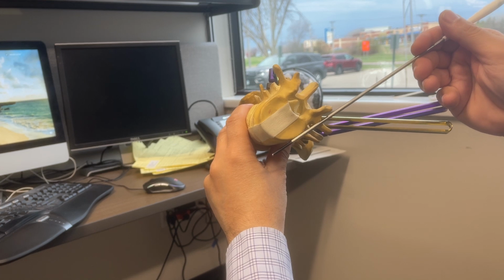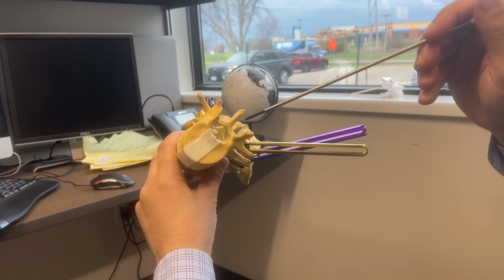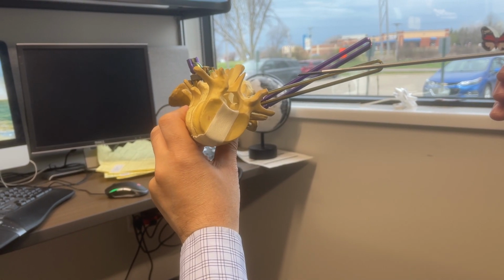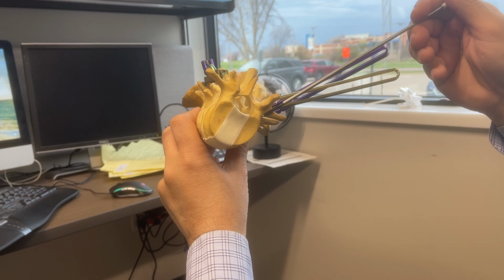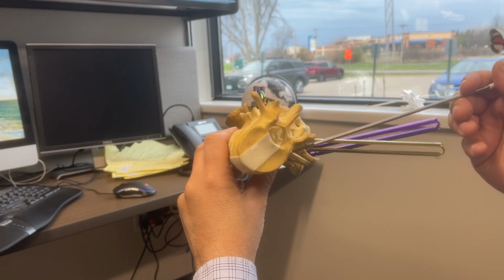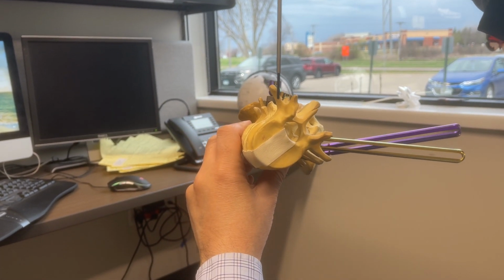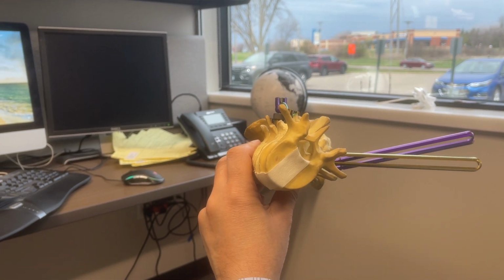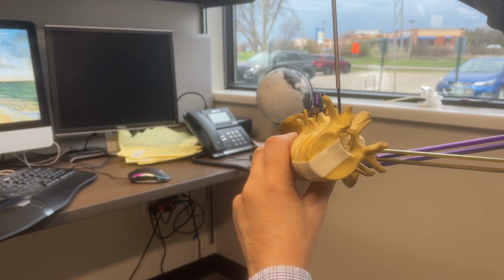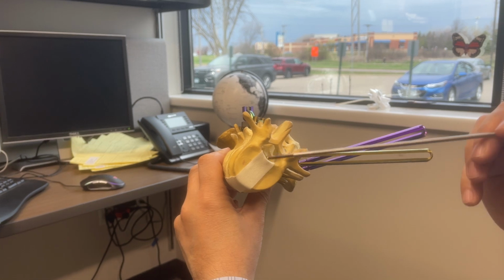Now, as a matter of fact, this is one of those situations where if there's a huge rotation, like as you see here, like 45 degrees, but even 35 degrees is quite tricky. Eventually, at a certain point, it's really not safe to go through the left side because of the rotation. Then I go from the other side. I still stay on the left side, but I bend over the patient, and then I go from the right side, where the angle to the Trans Kambin approach is more favorable.